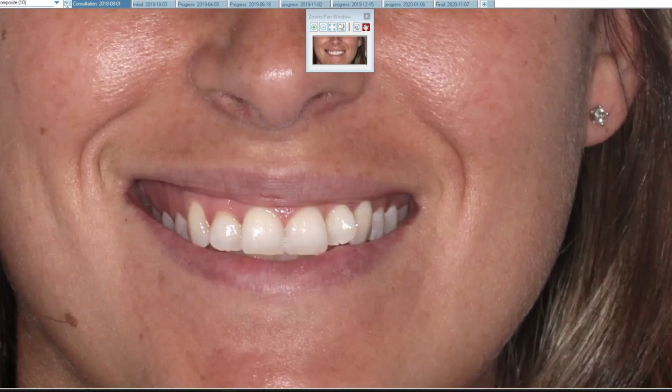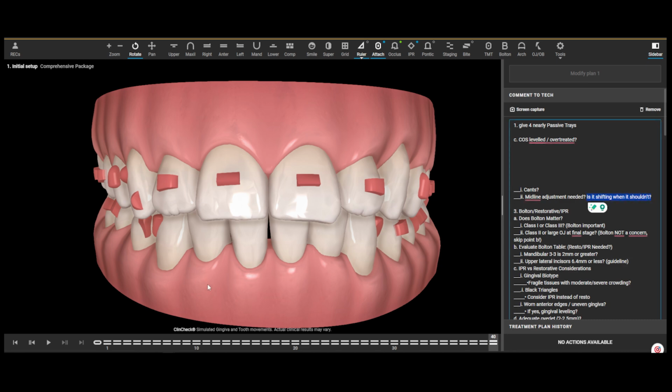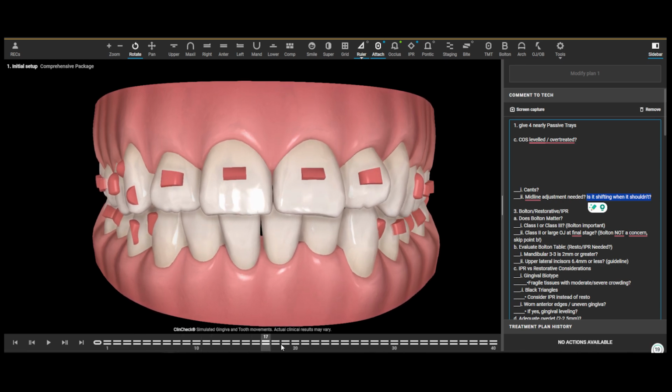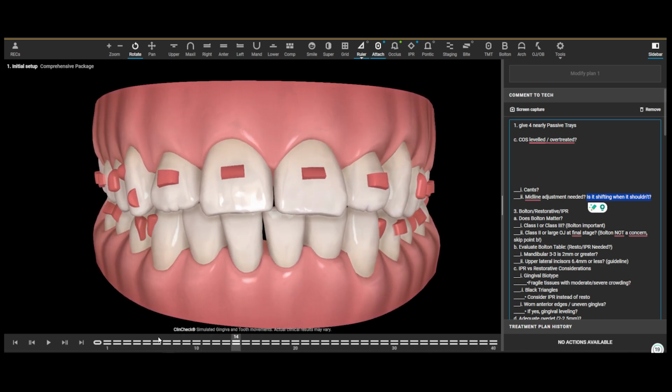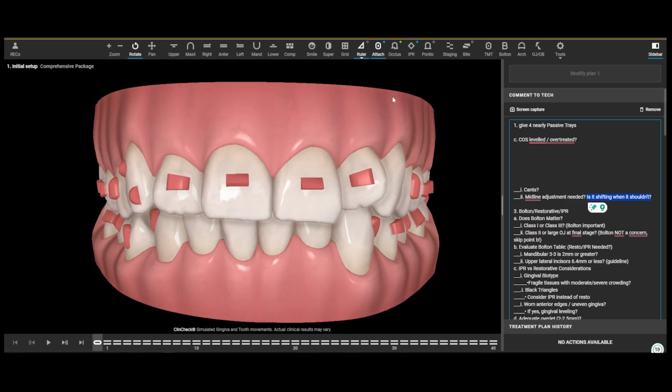Now, one of the things in the prescription form that I realized is I had noticed that her midline was shifted to her left. So cant, yes, we need to adjust that a little bit more. Midline adjustment needed. And so is it either shifting when it shouldn't, or does the midline need to be moved? So it's not shifting, well, I guess we can look at it first. Is it shifting the wrong way? No, it's actually moving to the patient's right.